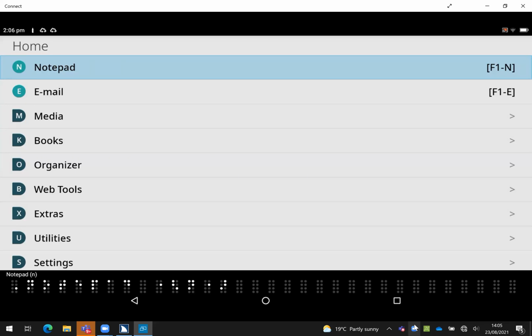We are aware of some problems users have been having with Gmail. When you try to delete a message, it loses connectivity. Unfortunately, I was not able to reproduce this on my unit on the Gmail account I was adding today, but I was able to reproduce it for somebody else. So we are looking into that with HIMS, and they are looking at the problem because it seems to be specific to certain Gmail accounts, and we're not sure why.